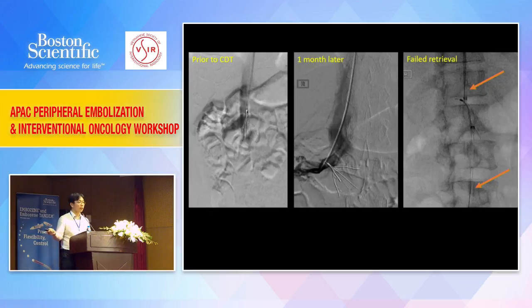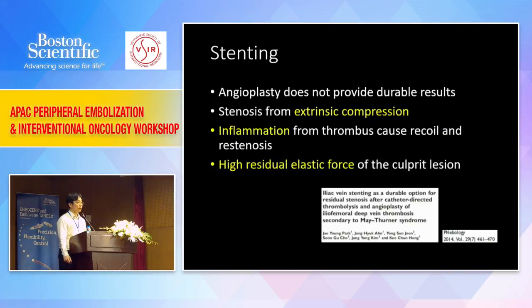Okay? Never ever do that, because this is called a ragdoll appearance. You never ever pull it, because you're just going to cause more damage. The patient went for an open removal of the IVC filter, and he's doing very, very well.